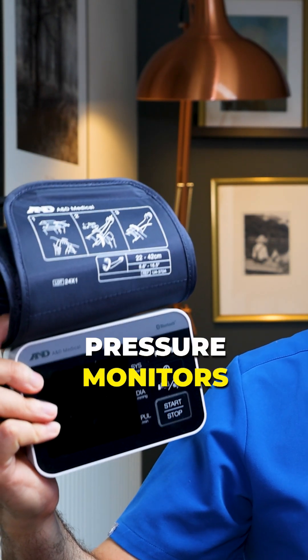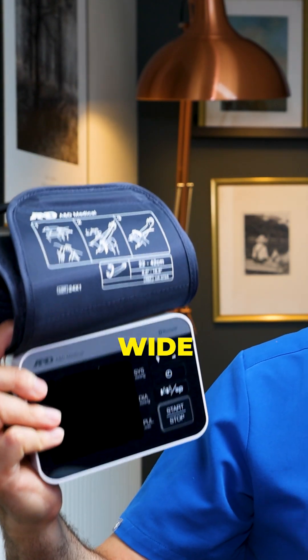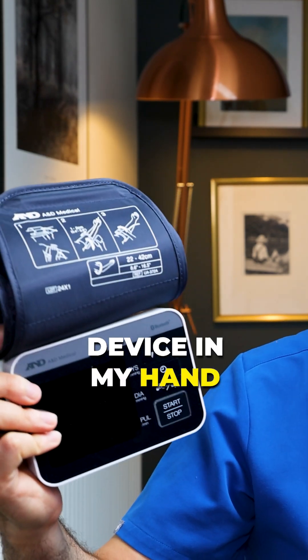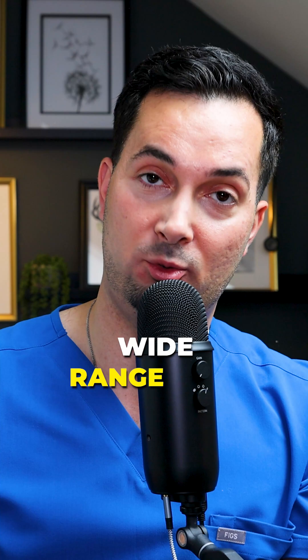Thankfully, most of our A&D medical blood pressure monitors come with the standard wide range cuff. For example, the A&D medical Precision Check Pro device in my hand — this comes with the standard wide range cuff size.